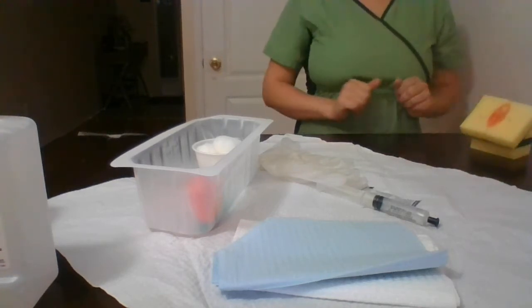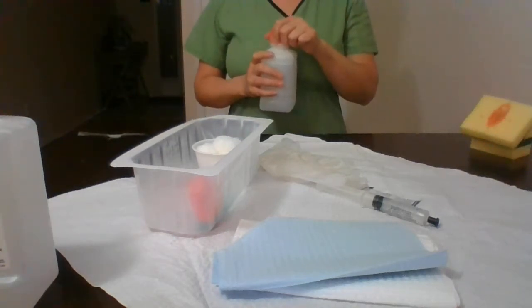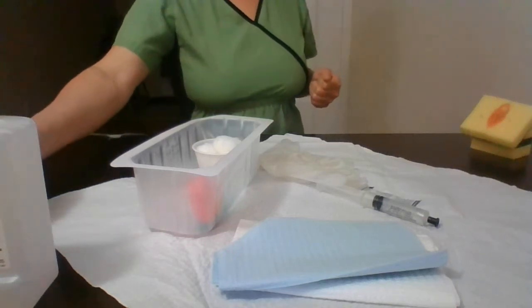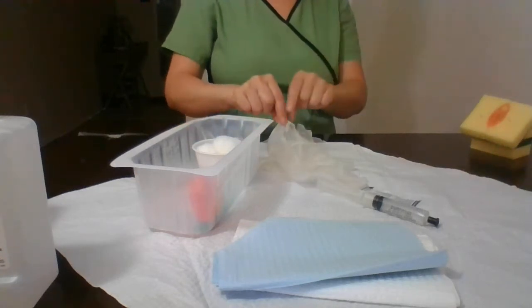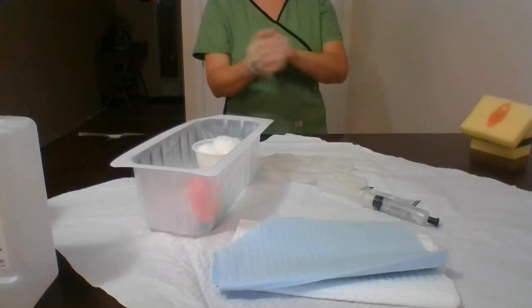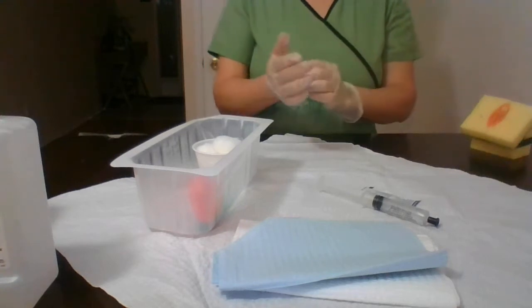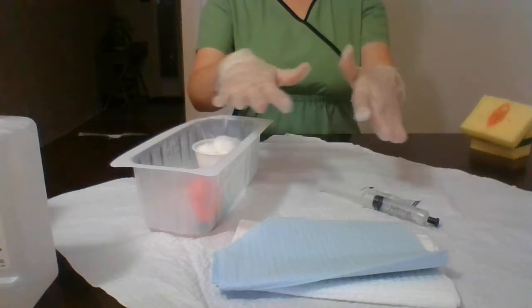Okay, the patient is all prepared, and I will also pour my betadine into my cotton container. Now my gloves are sterile, so I can touch anything within my field.